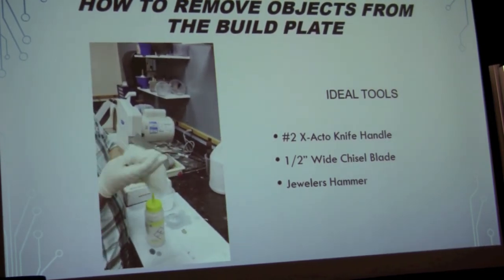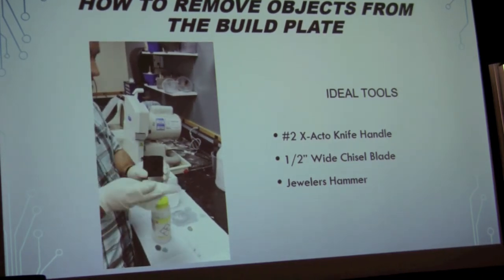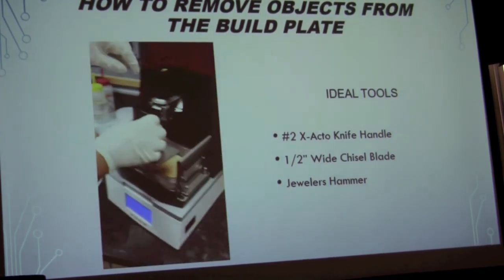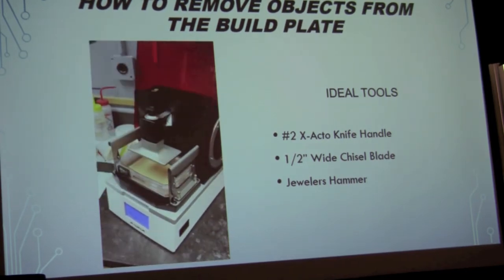Make sure that when you do this, you always wear gloves. This resin can be toxic before it's cured, so you don't want to expose your skin to it. And once you clean your build head, it goes back in and you're ready for your next print job.